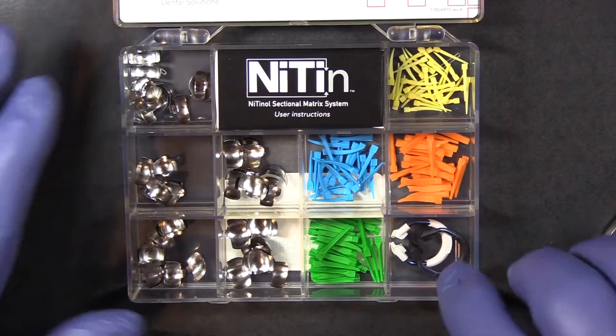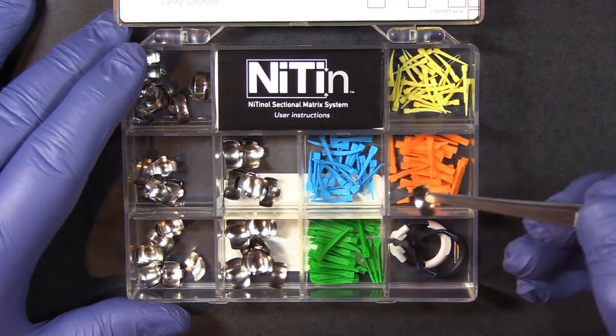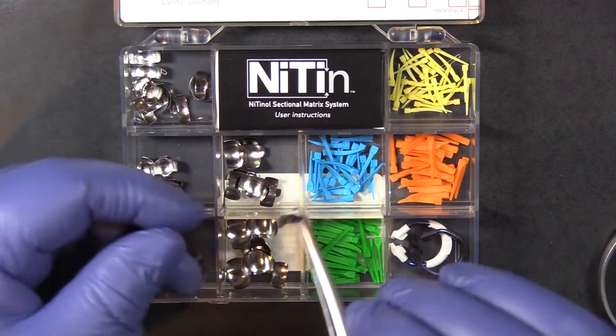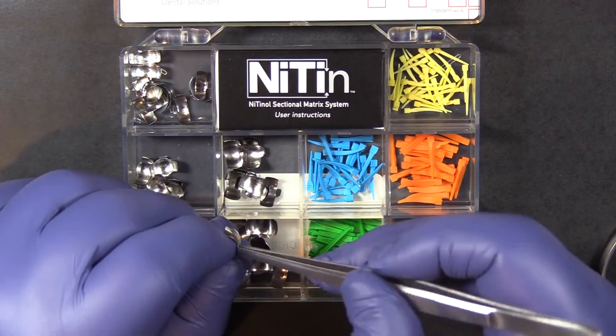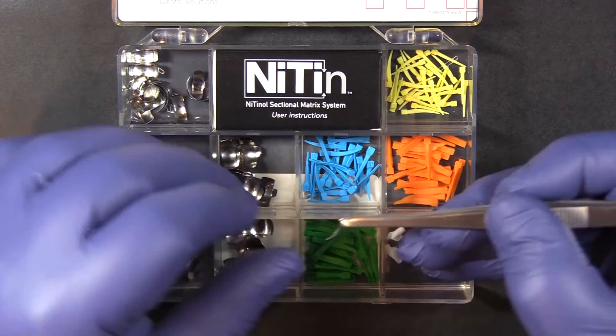We have five sizes of 15 ten-thousandths dead soft stainless steel matrix bands. They are very flexible, pre-contoured in three dimensions, and have a placement tab to simplify that process.